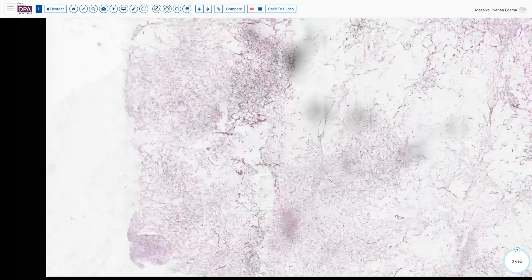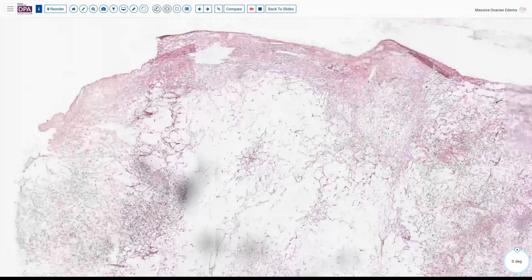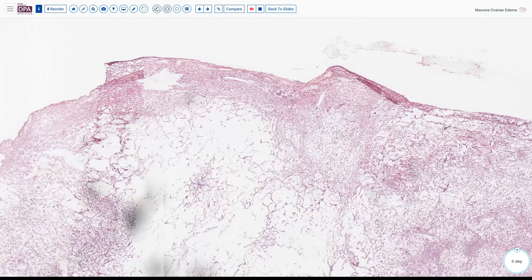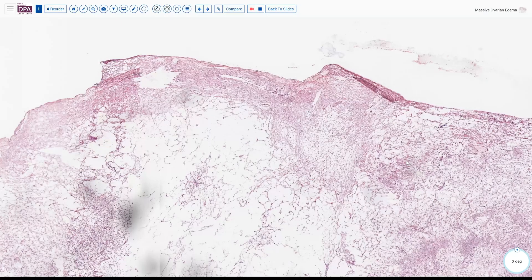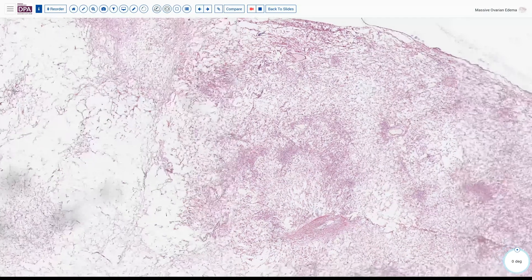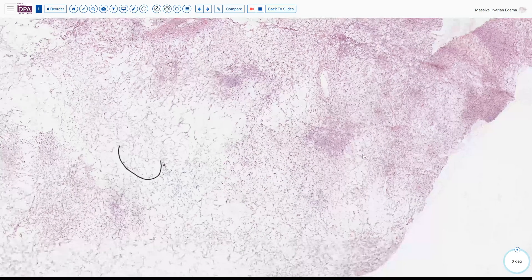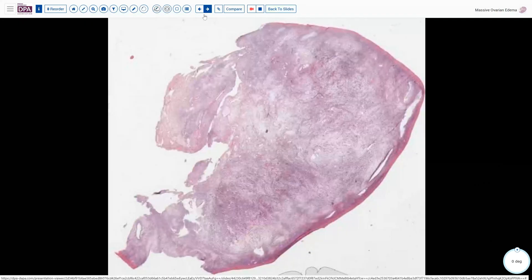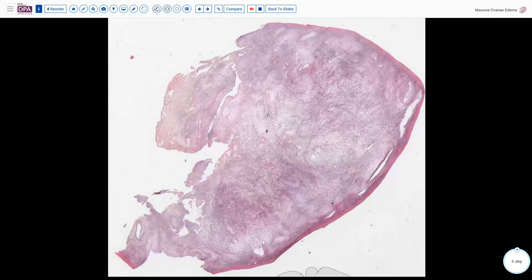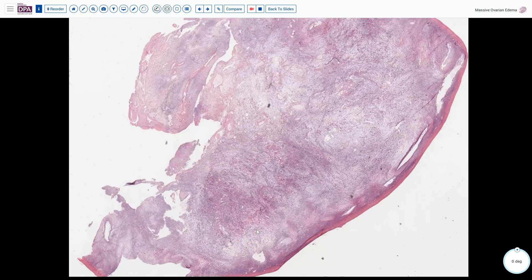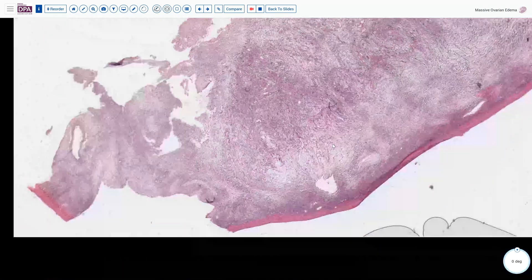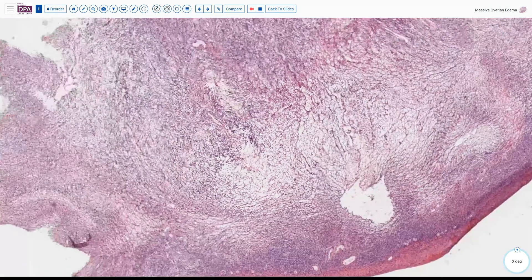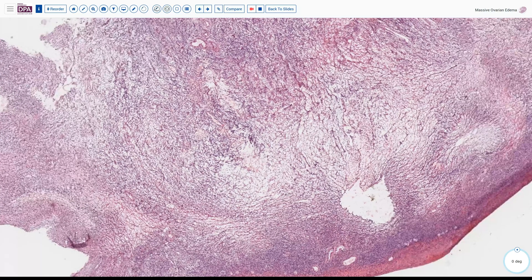Our impression on the frozen section was massively edematous ovary, and of course we would sample several areas to make sure that we were appropriately getting a view of what the pathologic changes were. Here are the permanent sections from this. It looks less edematous but we can see that we do have some follicular structures and a little bit of residual tissue.